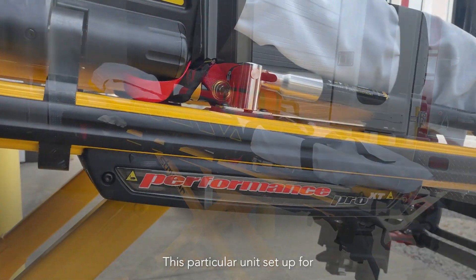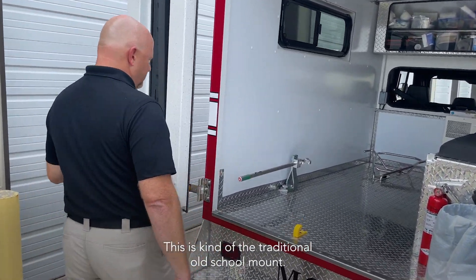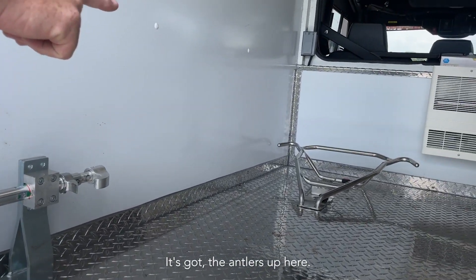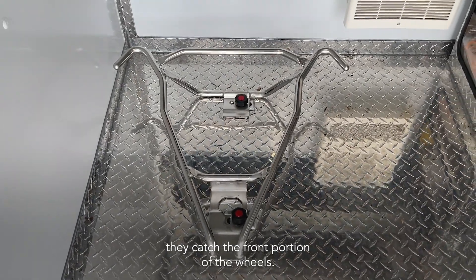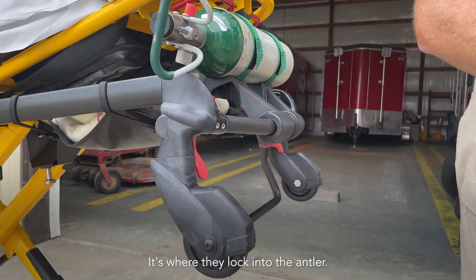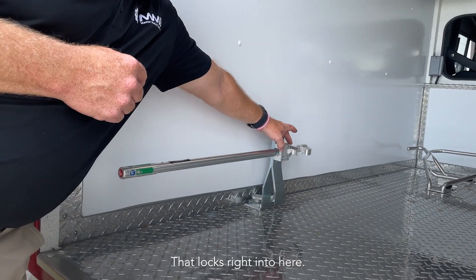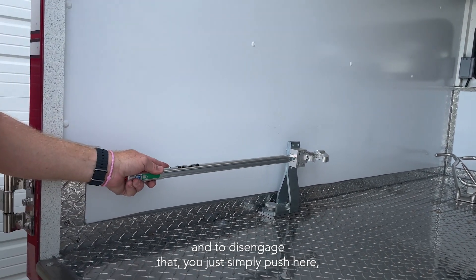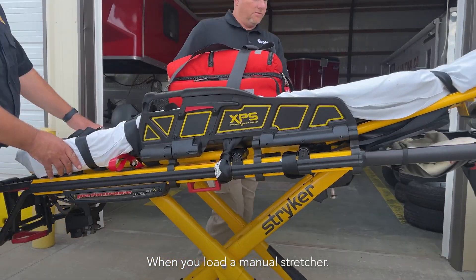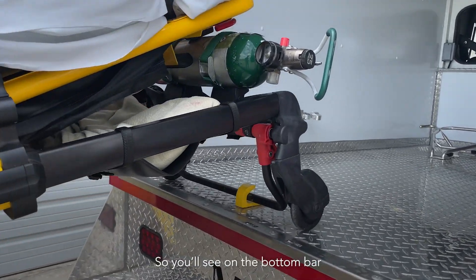Now let's look at the load system. This particular unit is set up for what we call an antler system. This is kind of the traditional, old-school mount. It has antlers up here that catch the front portion of the wheels. Right here is where they lock into the antler, and then there's a pin on the side of the stretcher that locks right in. To disengage that, you simply push here to unlock it.